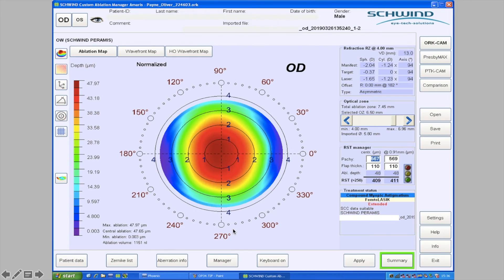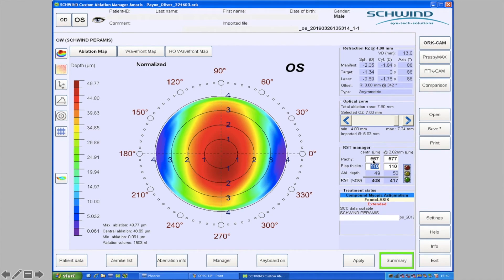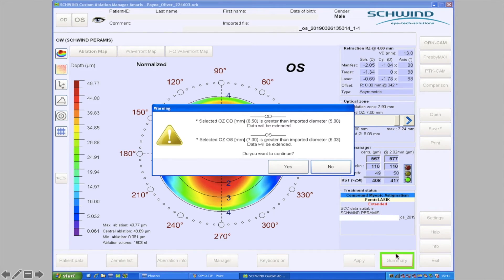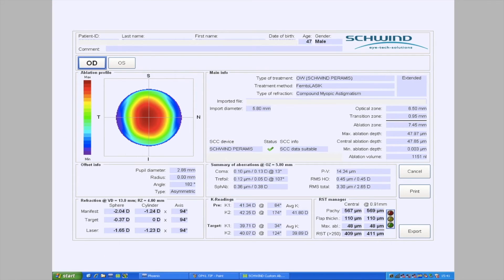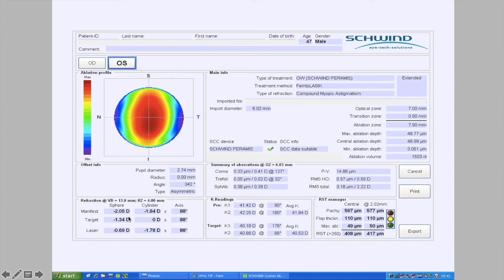We've already programmed the right eye, and from here we're on familiar ground for Schwind users — the steps after this are exactly the same as programming aberration-free treatments. Click OK, tab through the check screens, put in pachymetry data for both eyes, and hit the summary box. The software warning is just telling us the optical zone is larger than the wavefront scan acquisition diameter, which is common. Provided the acquisition diameter is larger than 5.5 mm, there's no problem going out to a default 6.5 mm zone — you're allowed up to a 1 mm expansion. Then proceed to the final summary screens for all checks and export your treatment.